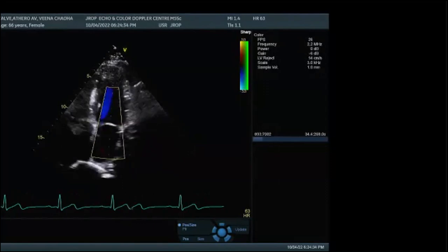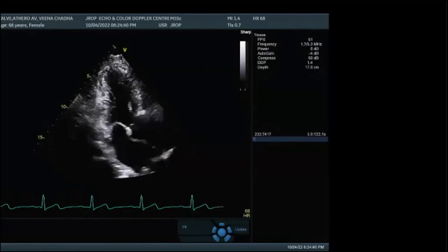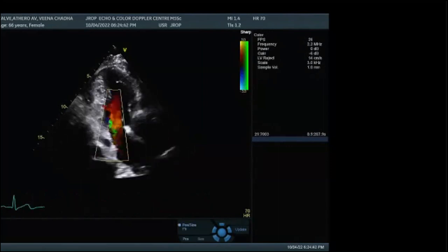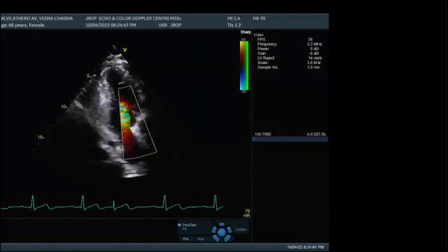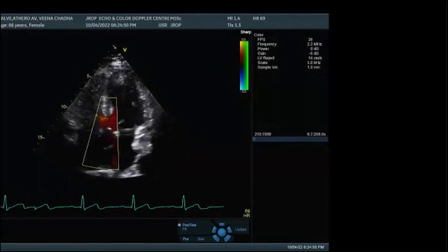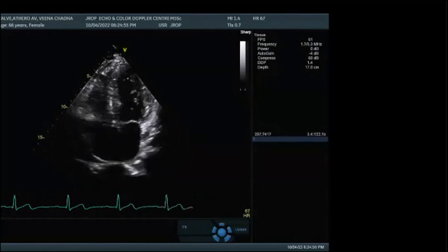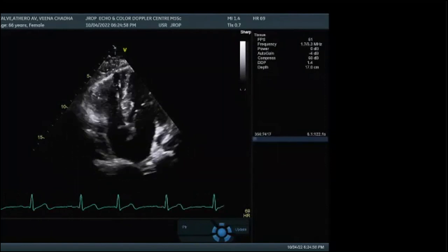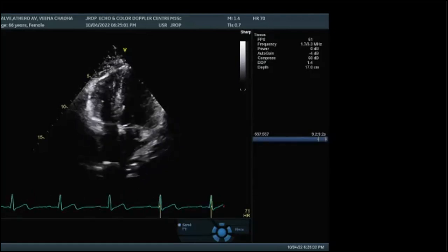In mitral regurgitations, you can use 2 chamber, 4 chamber, or 3 chamber because the mitral valve would be seen in all views. So use this particular window. For aortic valve, you can use 3 chamber or you can use 5 chamber. Similarly, for tricuspid valve, you can use the focused normal 4 chamber or focused RVRA. And we can use a few more windows in these valves. So whenever you are in that particular situation, you can focus accordingly.